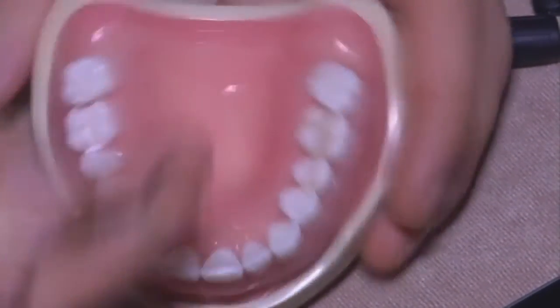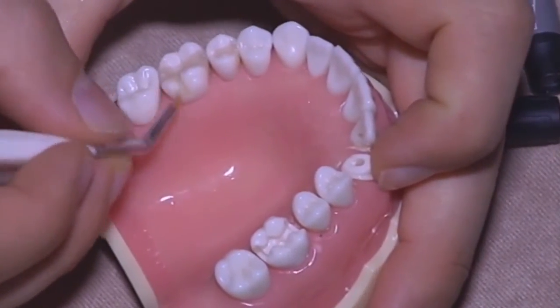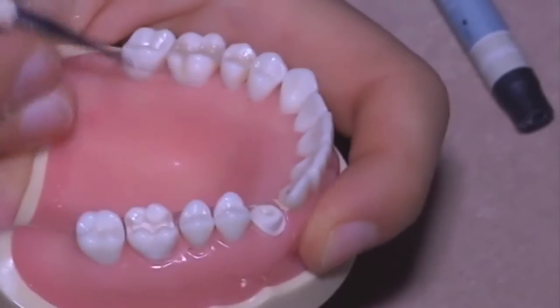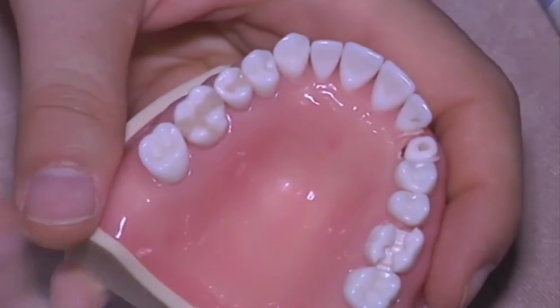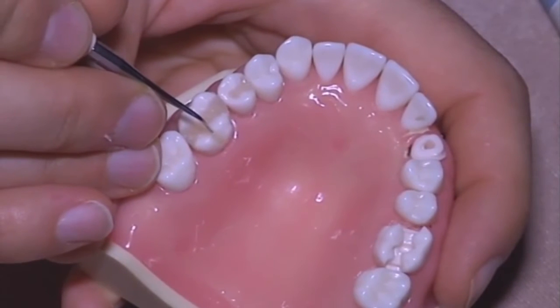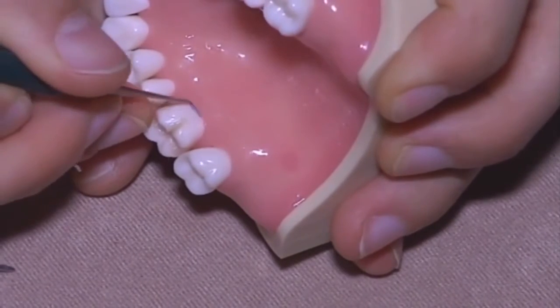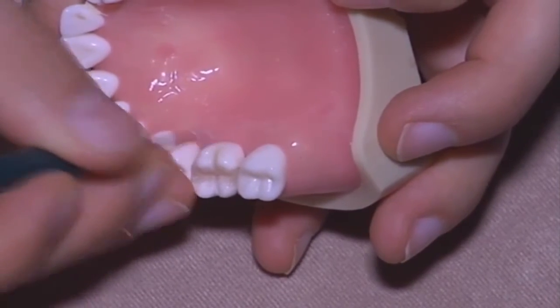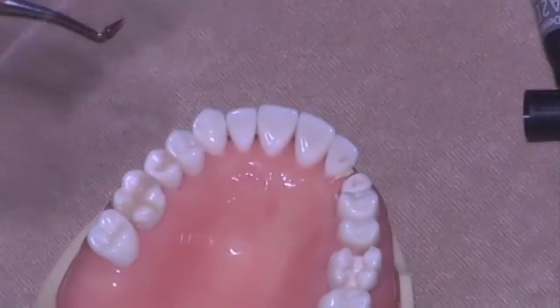Then at the end you just need to clean the brush with alcohol. I think we get the point.